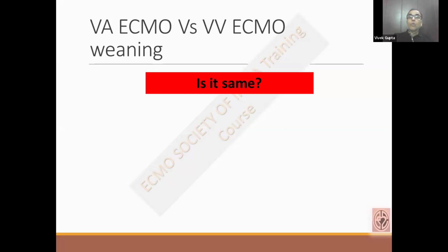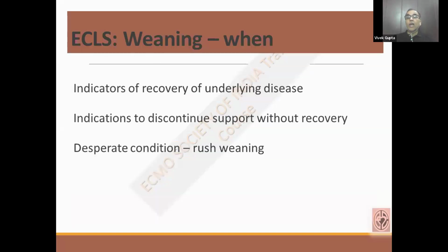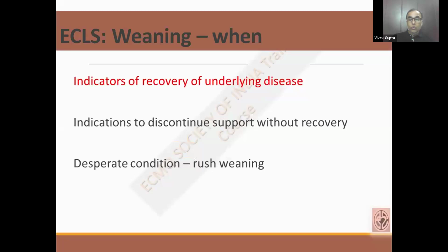So is VA ECMO and VV ECMO weaning the same? No. In all terms, including assessment criteria, how we wean these patients, and how long it takes for weaning of patients, all are different. So we should always plan, think, and execute our weaning protocols according to the type of ECMO we have, what ECMO support is being given. So when to do this weaning? We can understand if recovery is there, or therapy is discontinued without recovery, or desperate. So let's take one by one.